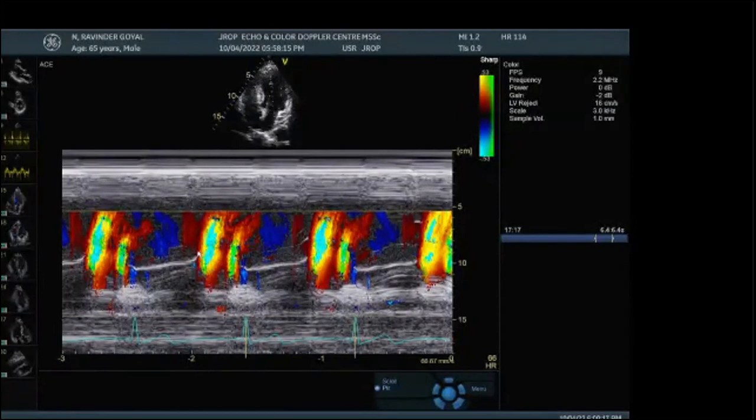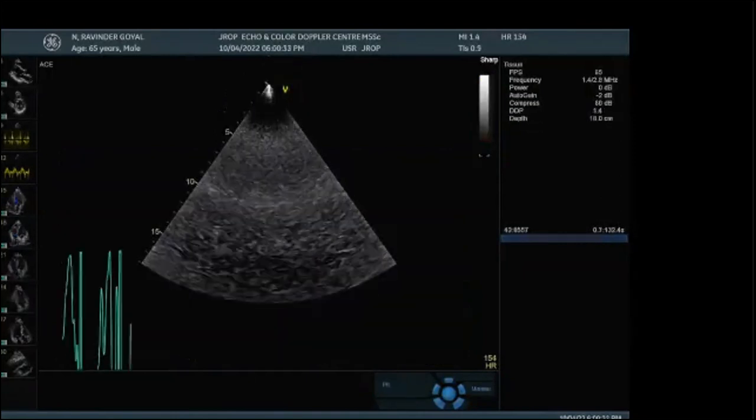You are talking about the size of the box in color Doppler. Sir, what is the significance? What if it is bigger and what if it is smaller? Sirisha, if the size is bigger, then we have a drop in frame rate. Look at the screen now.